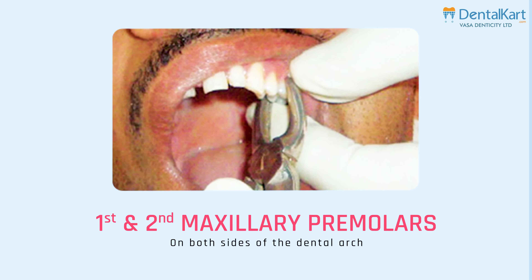This kit includes a variety of forceps with different shapes, sizes, and angles to accommodate the diverse anatomy of teeth and facilitate their extraction. These extraction forceps allow us to perform extractions with accuracy, control, and minimal trauma to the surrounding tissue. Moving on to the components of extraction forceps: an extraction forcep consists of a handle, hinge, and beaks.